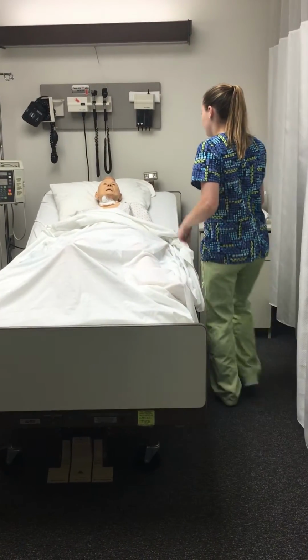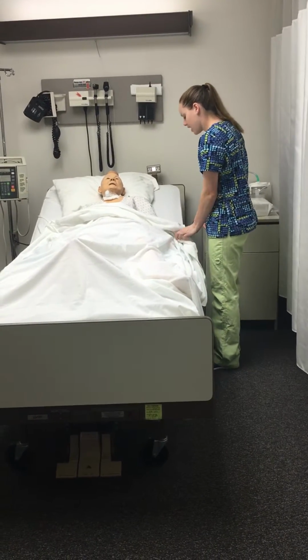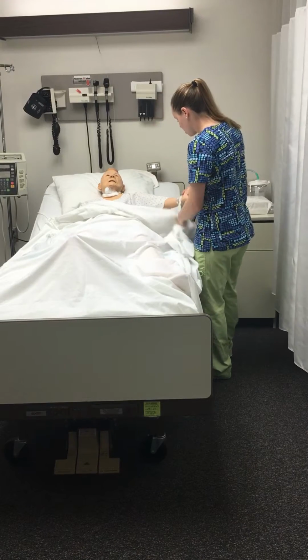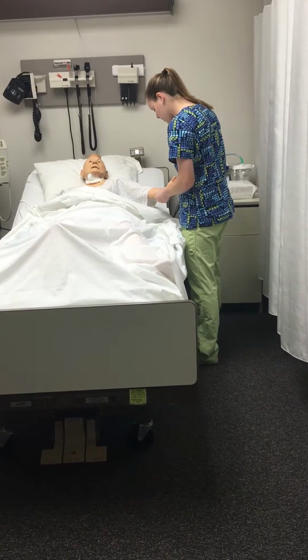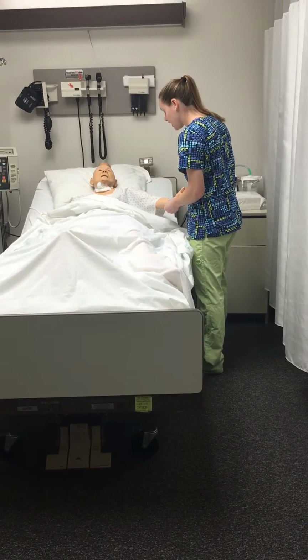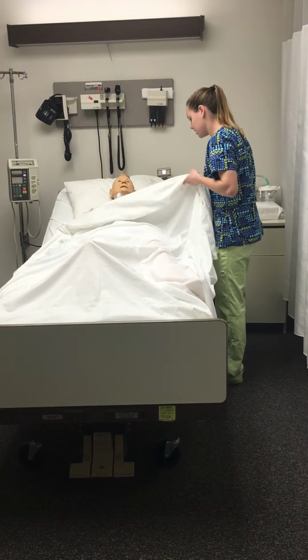So going over to my patient, hi, my name is Alex, and I'm going to be your student nurse today. And can I just see your wristband for identification? And your name is Jerry Jazz, and your date of birth is 3/15/1939. He says that's correct. And so now that I have the two identifiers, I can proceed.